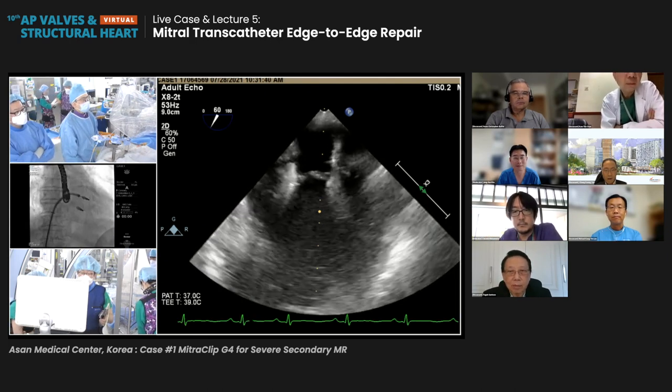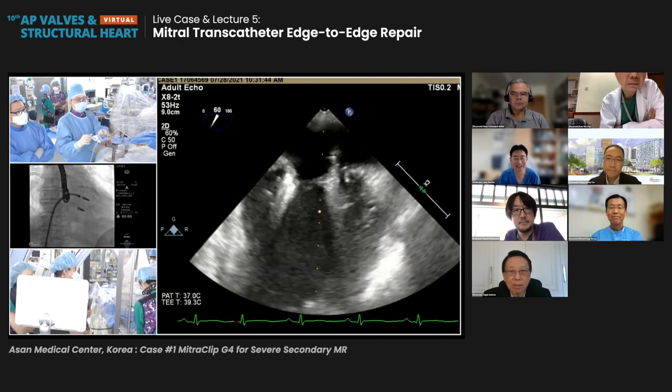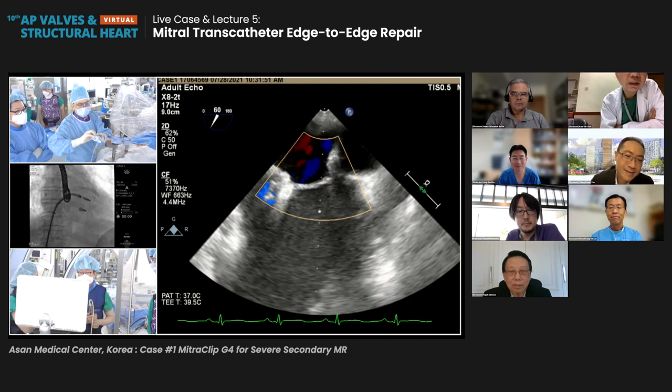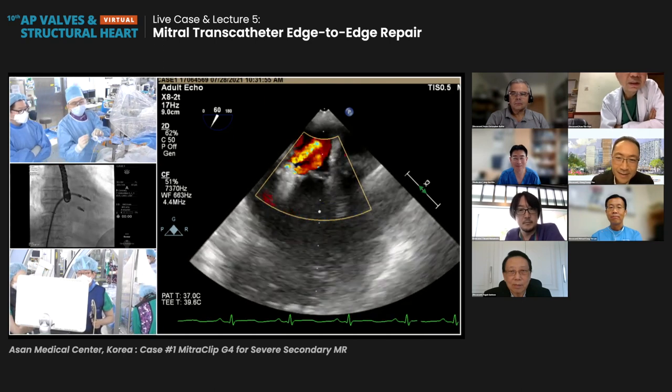I think the NTW was the best option compared to the XTW. Thank you, panelists. Okay, then I will detach the clip. Do you agree? Yeah, NTW was the better option. Thank you, Dr. Matsumoto.